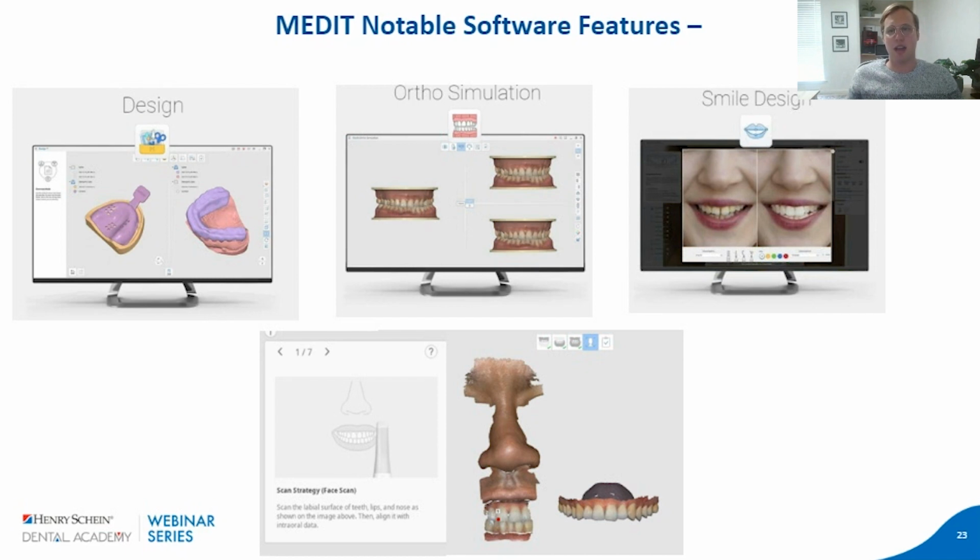They also have within ortho simulation, you can do what's called a face scan from MEDIT, so you can actually scan your face. I haven't gotten good at that, or otherwise I'd show a video, but it's very unique to MEDIT. I don't know of any other scanners where you can actually scan your own face to incorporate that within patient presentation of the case.